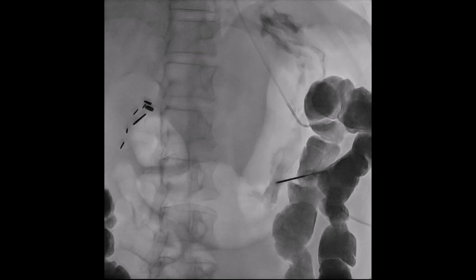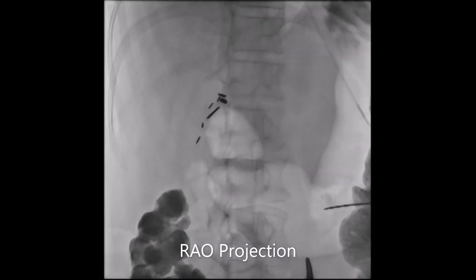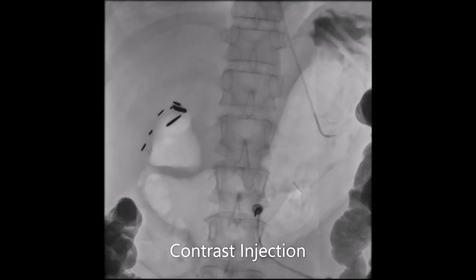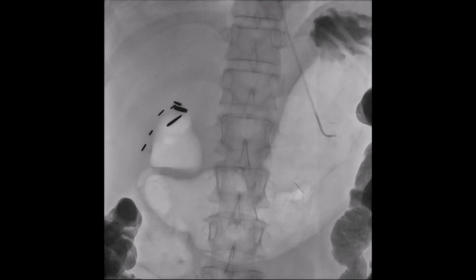This is a still shot in the AP projection after injecting contrast through the T-tack needle. You can see contrast outlining the rugal folds along the stomach. The first T-fastener has already been deployed, and now I am seating the second T-tack in the AP plane, getting the same barrel-on-end appearance before advancing in the RAO trajectory. Here is a slow-motion clip of me advancing the second needle into the gastric lumen. After advancing the needle, I aspirate air and inject contrast to confirm positioning. Both T-tacks have now been deployed and we're ready to begin placing the gastrostomy tube.